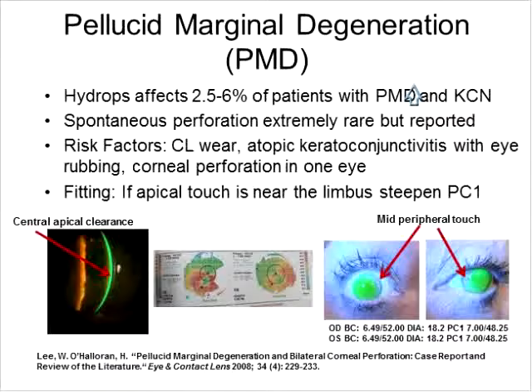Let me just ask this, the follow-on to that same question. If you did have a patient that truly has residual astigmatism, and it's not due to lens flexure, so you can't fix the residual astigmatism by making the lens thicker, Mindy, how do you actually go about making that lens and getting it to stay aligned on the eye?